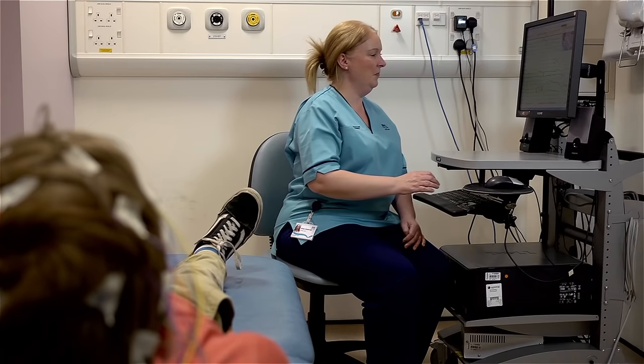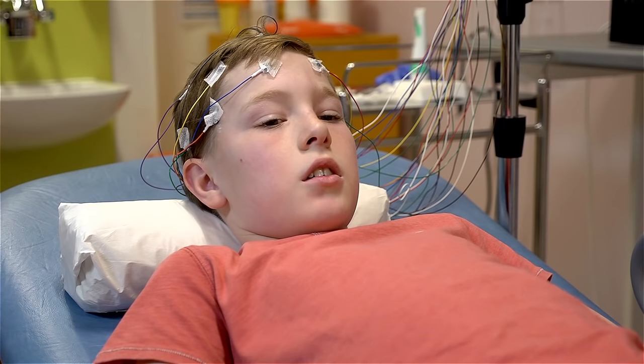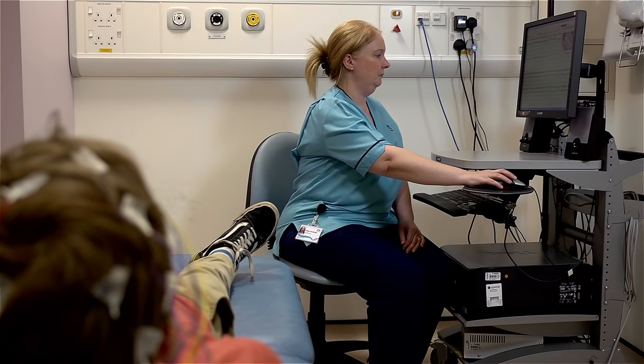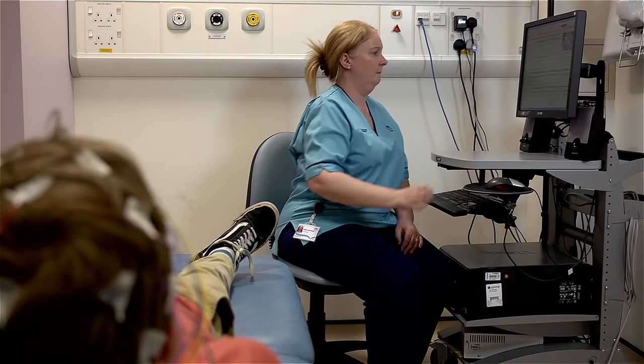Okay Robert, we'll just have you lying there for a few minutes, nice and relaxed. And then we'll get you to do a little bit of deep breathing. If you can close your eyes for me and just relax.